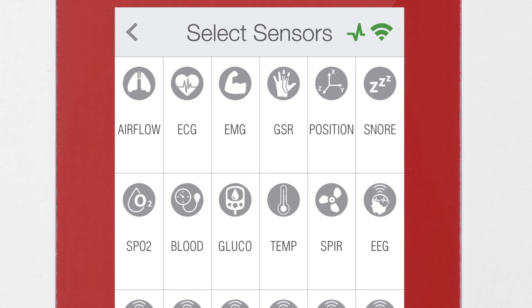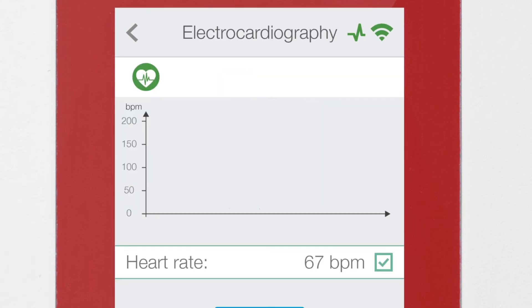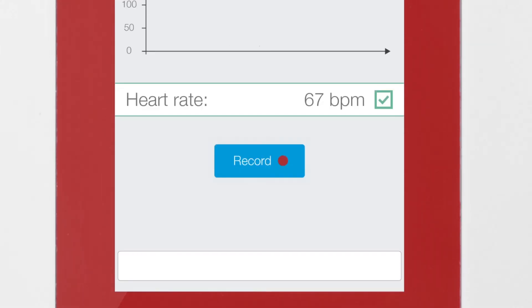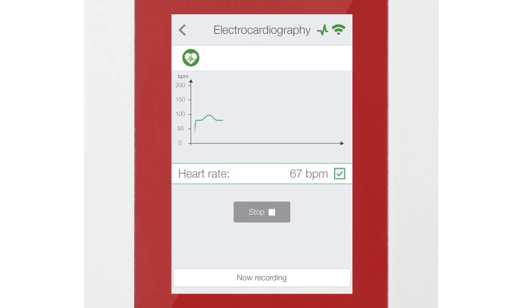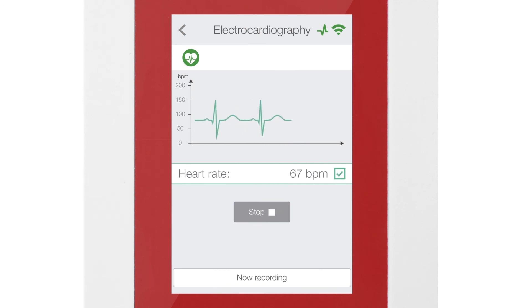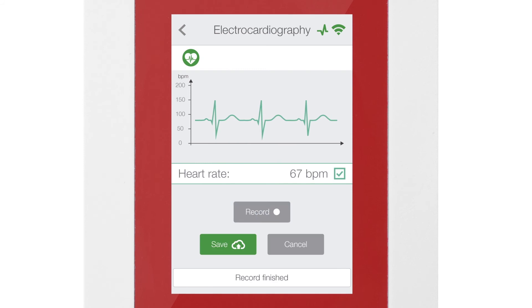The RAW mode allows you to record the entire wave instead of discrete values. To start using the RAW mode, push the Record button. MySignals will record up to 30 seconds unless you decide to stop the recording by clicking on the Stop button before that duration.